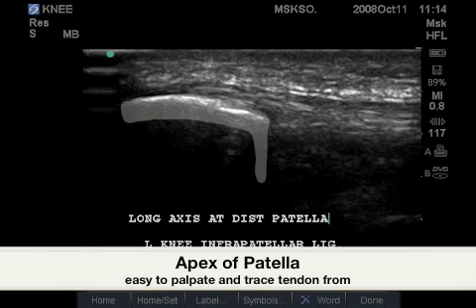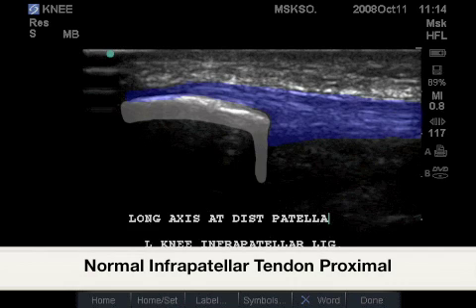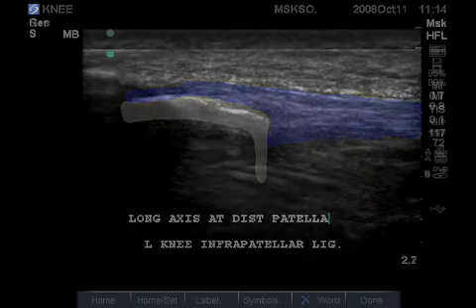Highlighted in white is the bony anatomy of the apex of the patella at its narrowest point. In blue is the proximal infrapatellar tendon.